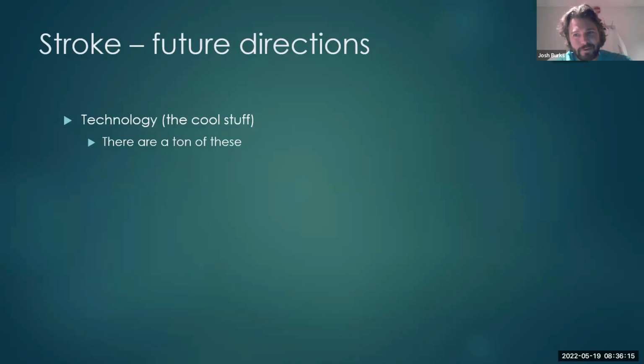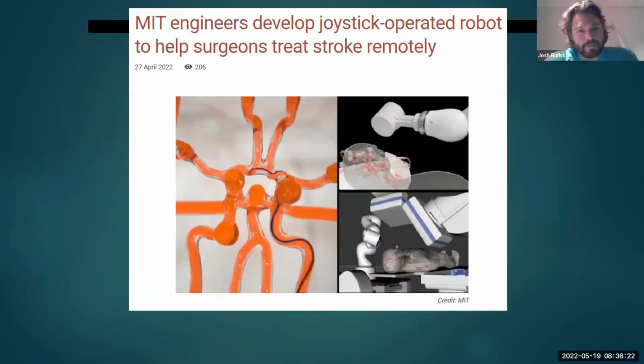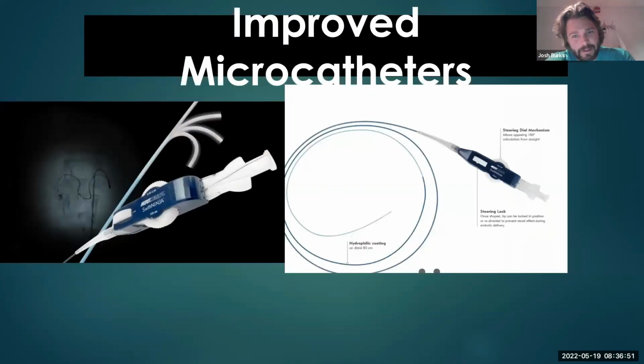There's some really cool stuff and technology that they're putting out and that's being developed. With the small wires that we use, there are obviously some limitations. You put a shape on the wire before you put it in, and then do your best to guide it in. But they're developing robotic wires that you can essentially use a joystick to steer and drive. This would certainly expedite access in cases with difficult anatomy, or if we were having difficulty crossing a clot. A little less high tech are these catheters, where you have a little turnstile that you use just to change how acute the angle is.